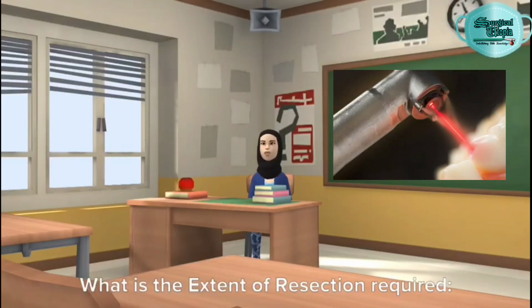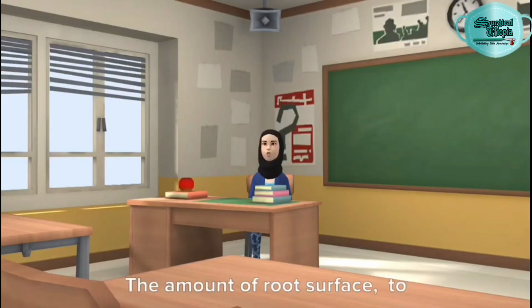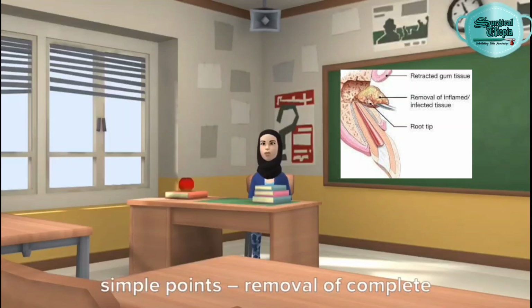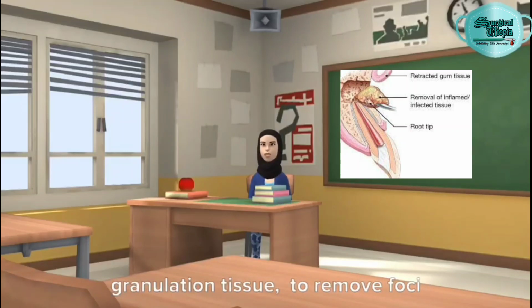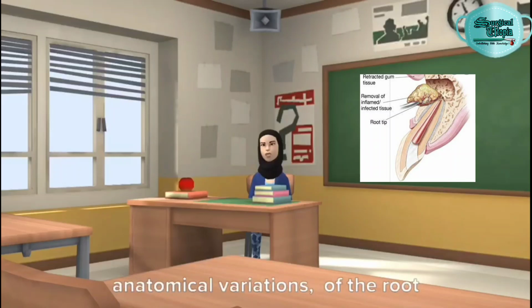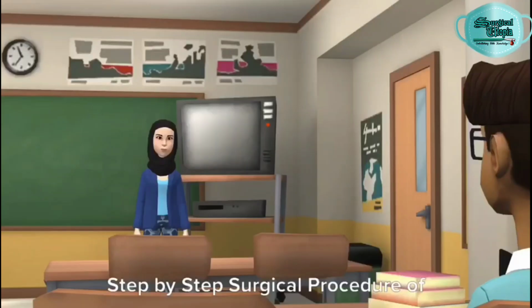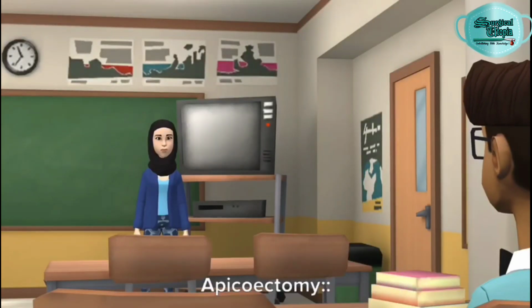What is the extent of resection required? The amount of root surface to be removed is decided based on two simple points: removal of complete granulation tissue, to remove foci of infection, and to eliminate any anatomical variations of the root structure and pulp chamber to prevent reinfection. Step-by-step surgical procedure of apicoectomy.